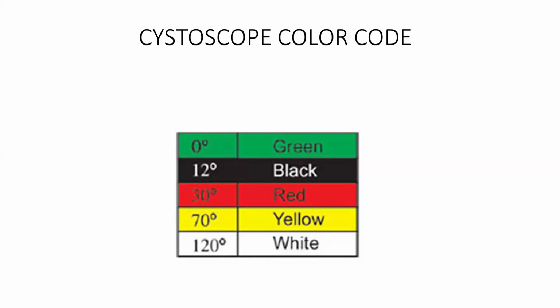See, earlier we used to get a narrow angle, means the vision was, I think, only 30° all around. Now with a wide angle, it is 60°. If you are taking 0° in the center, then all around you can see up to 60°. But one, I think we'll have to find out and confirm it. I tried to find out in literature also, but I'm not able to get it. But somewhere I read about that. So earlier scopes had a very narrow vision. Nowadays we are getting wide angle.